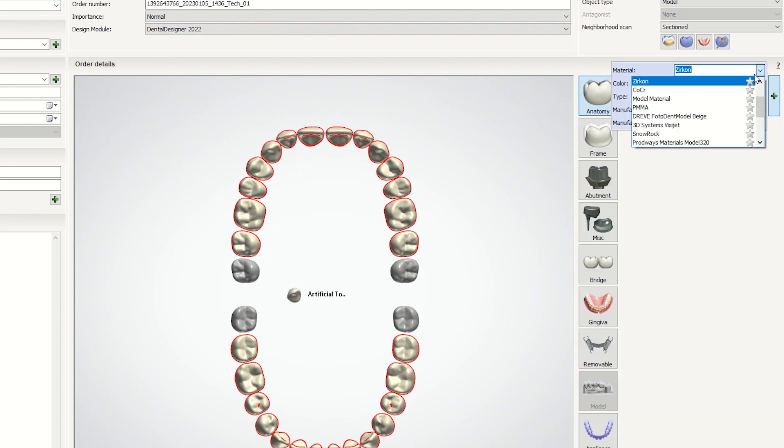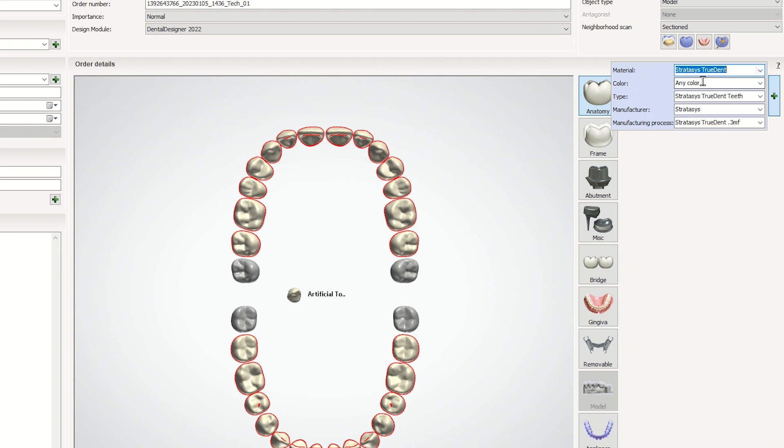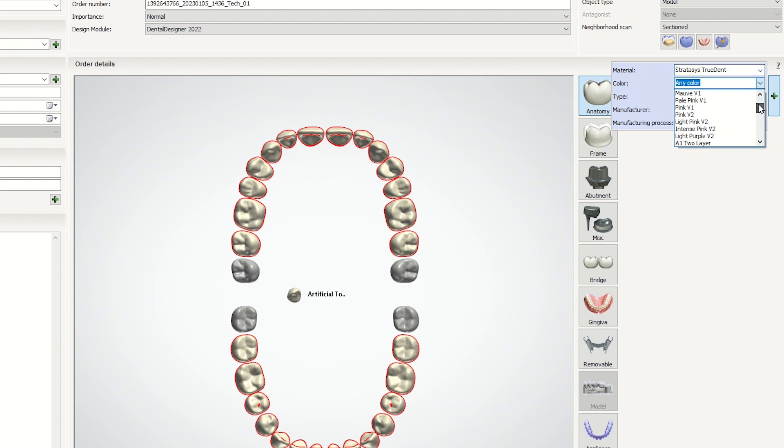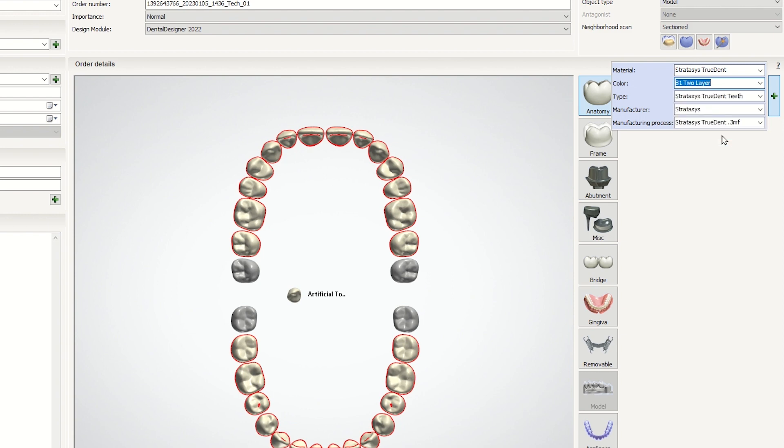Under Material, select Stratasys Trudent and the relevant teeth shade. We'll go with B1.